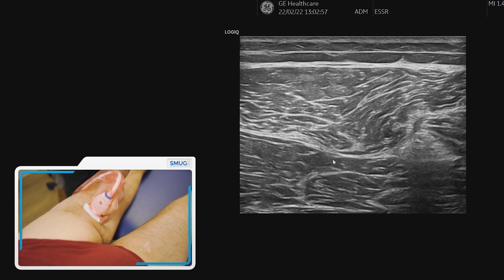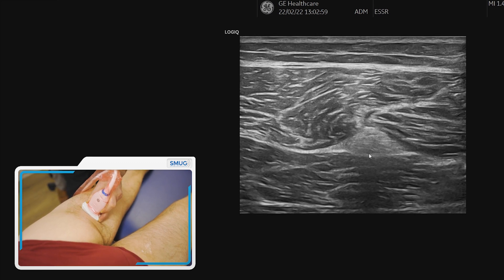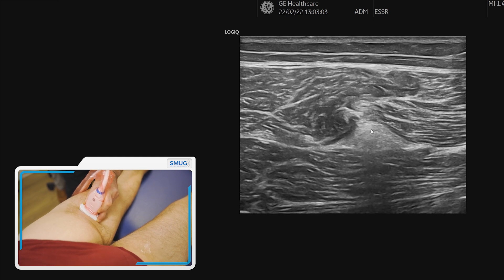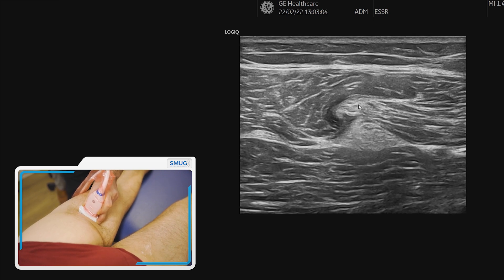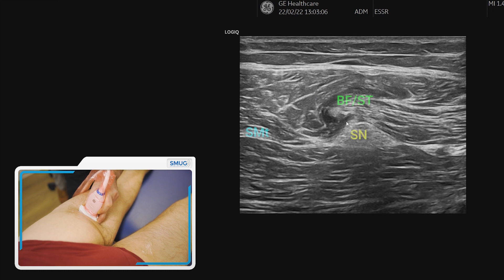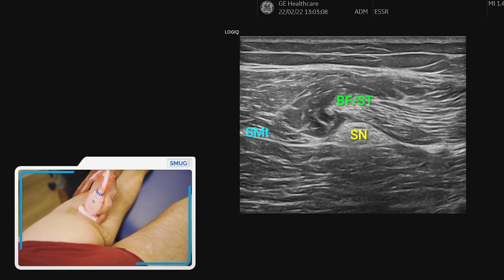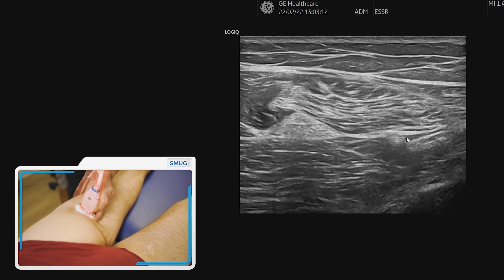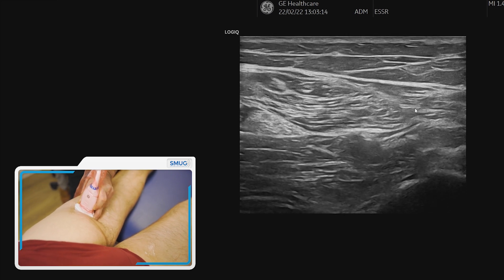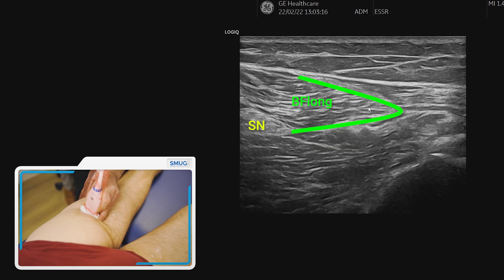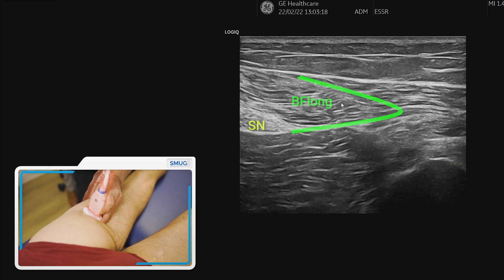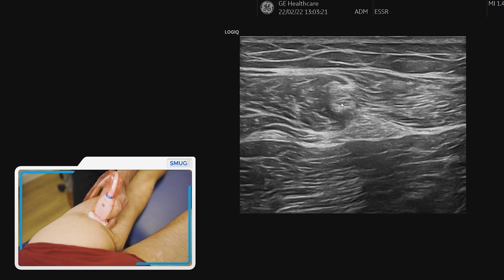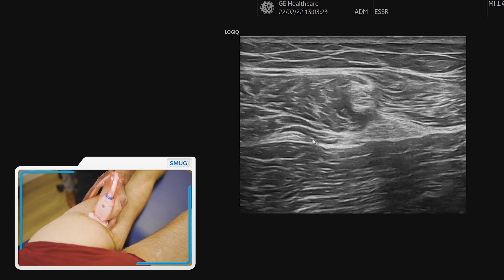Going back to the semimembranosus tendon and the deep fascia, following it laterally we see this big nodule which is the sciatic nerve. Above that is the conjoined tendon from the semitendinosus and the biceps. Following it further laterally along the deep fascial plane, you can see the end of that lateral compartment, which is the long head of biceps.